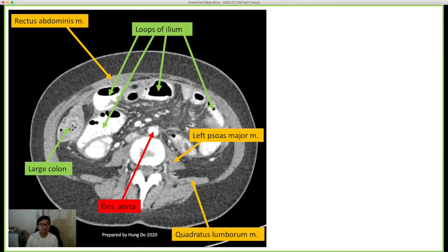The reason is, remember that exposure or the adequacy of density is related to all of the densities that you're meant to see. So we're meant to see the soft tissue, we're meant to see the contrast, we're meant to see the bone, etc. But if we can't see that, then there may not have been enough kVp, mAs to be able to adequately demonstrate the densities. For the most part, it will be mAs that is the problem because mAs is by far the highest controlling factor of density, and conversely, contrast is heavily influenced by your kVp.